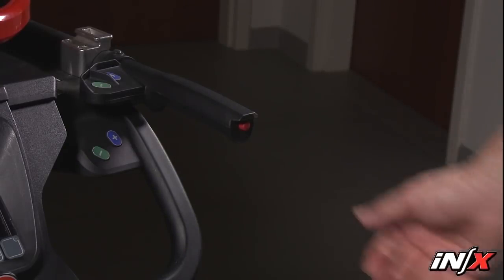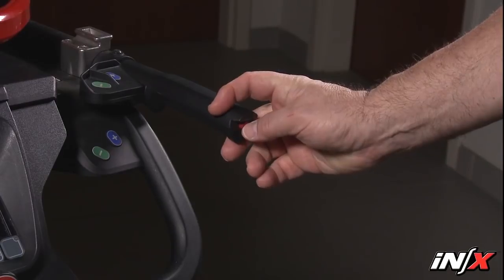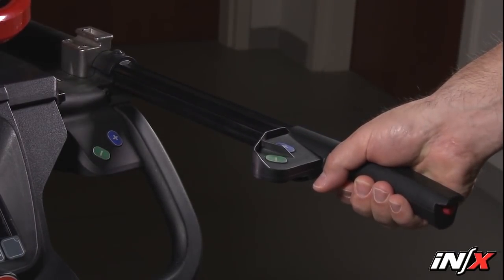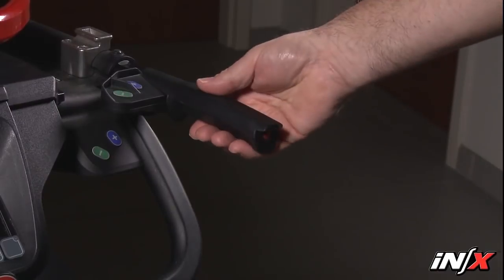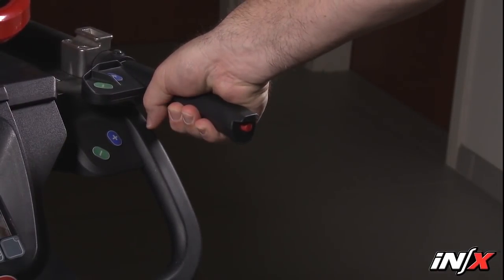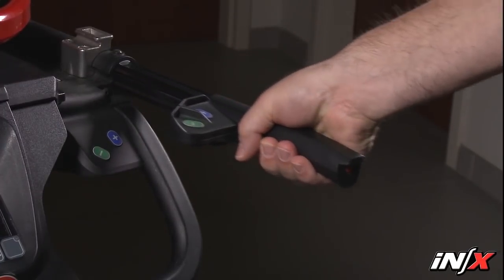The telescoping handles are useful when rolling and maneuvering the NX. The handles have two positions: fully retracted or fully extended. To change handle positions, press the red button on the end of the handle and push or pull the handle to its desired position. Release the button and pull or push the handle until it locks. Use the telescoping handles only when they're in the locked position. The attached set of control buttons remains with the hand grip in either position.